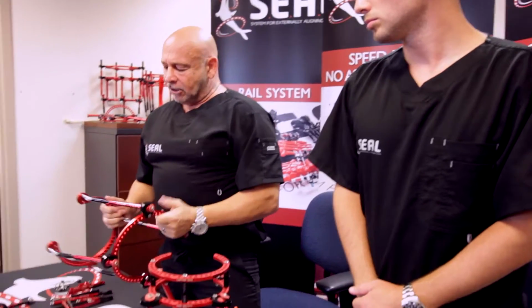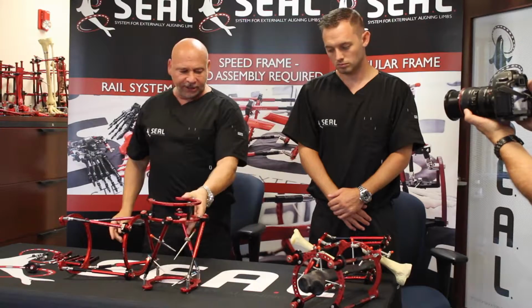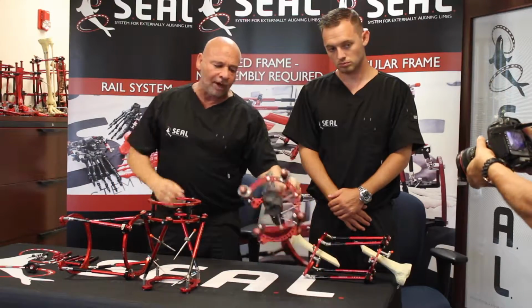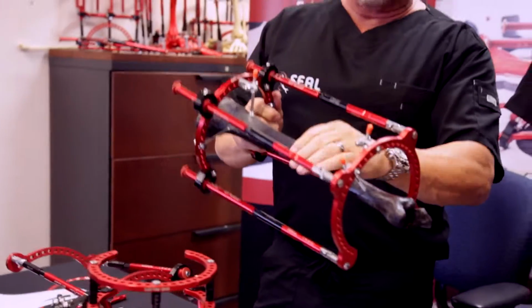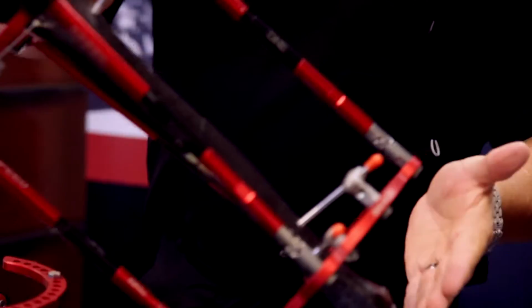between this. So you have the ability to have a fracture that you can rotate, angulate, do whatever you want to, then lock it in strong. And then if you want to do anything else with it, add a foot plate, maybe you want to distract the ankle, do something else.